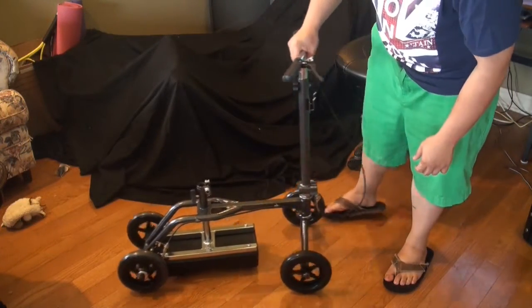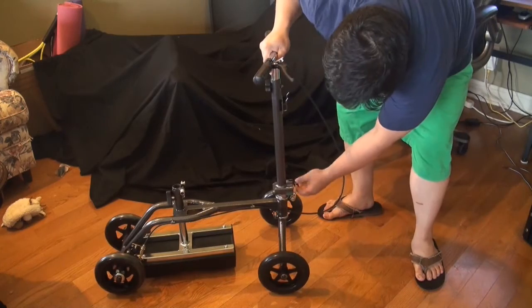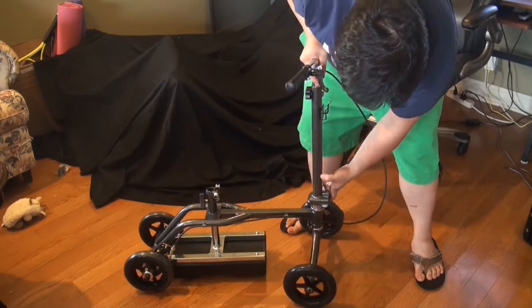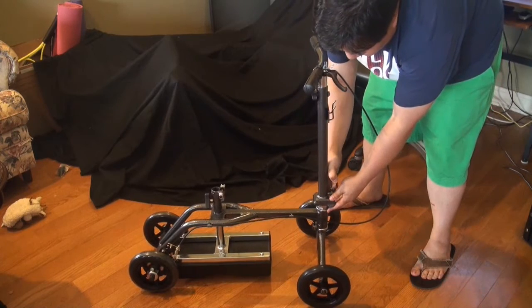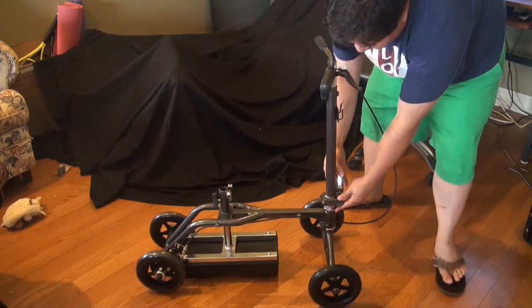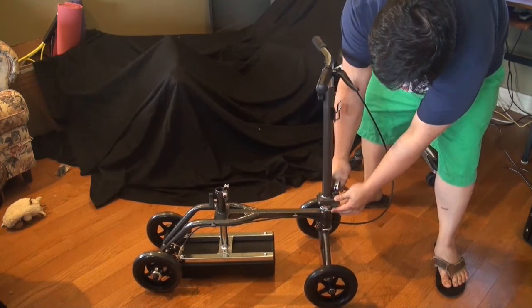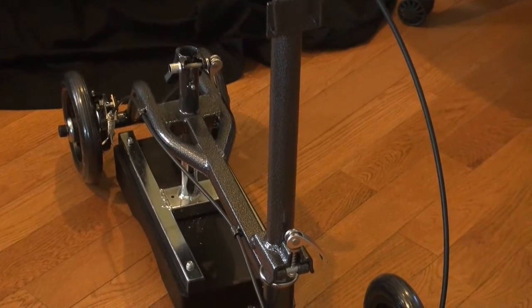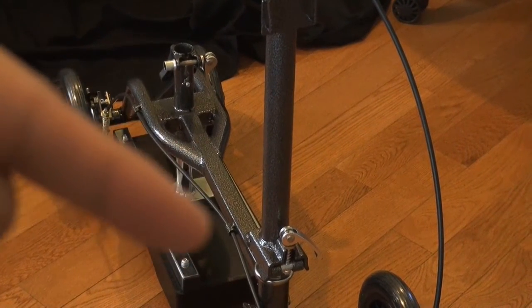First and foremost, you pull that handle up, and then you're going to need to press down that metal plate thing. Everything is in the instructions — I'm just going by the graphic representation. That little bar there is the one I just adjusted.